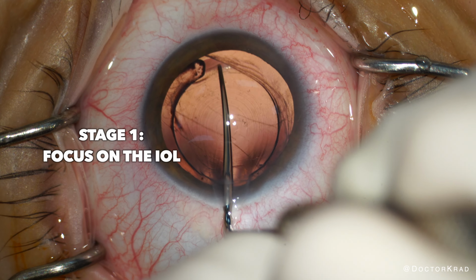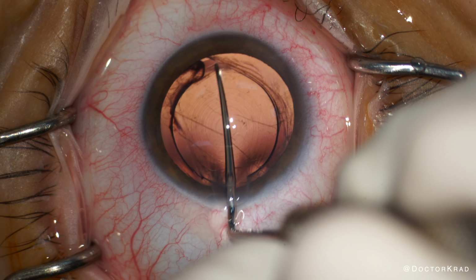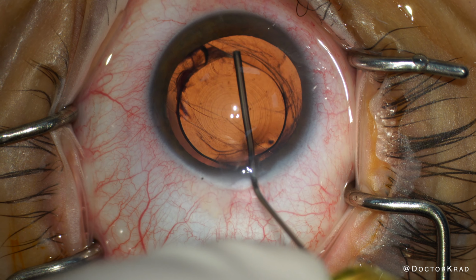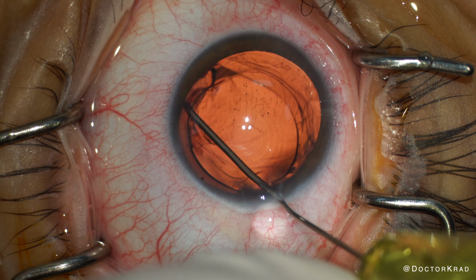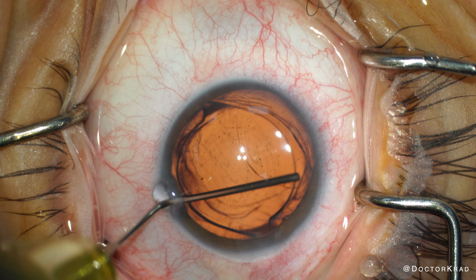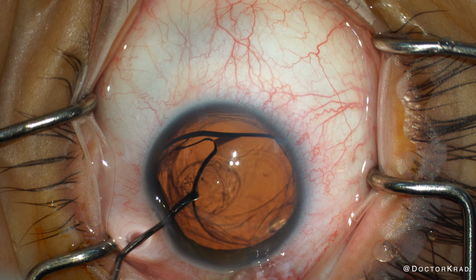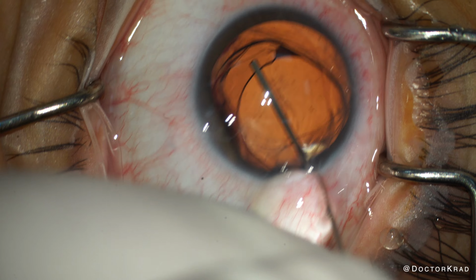I'm going to start opening up the capsule bag, so I use a sharp tip spatula, and I open the capsule where the haptic optic junction is, and then I'm going to use viscoelastic to expand the capsular bag, especially focusing on the area where the haptics are laying in the fornix of the capsule. And I want to be very generous with the viscoelastic, but also make sure that I'm paying attention to the intraocular pressure.